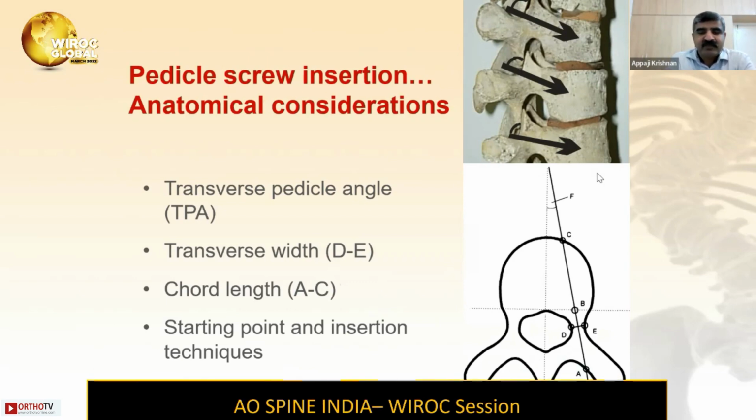As I told you, after exposure, you have to have this an open thoracic pedicle screw. You have to consider 4 important anatomical issues. One is the transverse pedicle angle, that is the angle between the entry point and into the body.